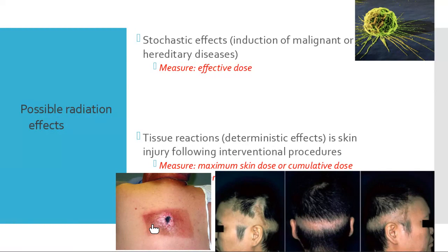We can ask ourselves why this is happening right now. It is because now we have very powerful X-rays. The amount of X-rays is huge. Remember that the first ever X-ray, provided by Professor Röntgen of his wife's hand, took 15 minutes to obtain enough density to form an image. So he irradiated his wife's hand for 15 minutes to obtain that image. But nowadays half a second is enough to generate some lethal damage or high damage for the patient. Why? Because nowadays we have very powerful X-ray tubes. If we don't use them wisely, it's easy to have an accident.